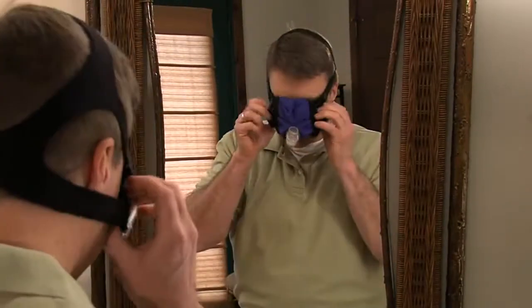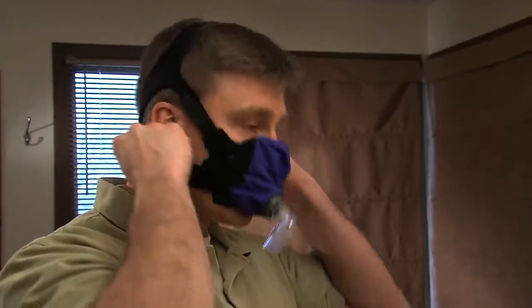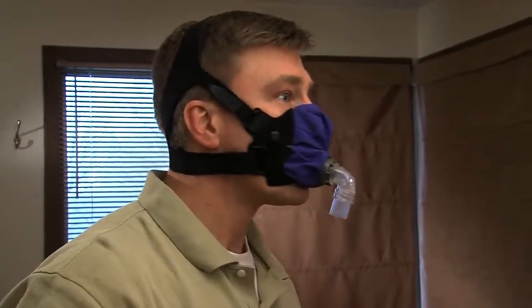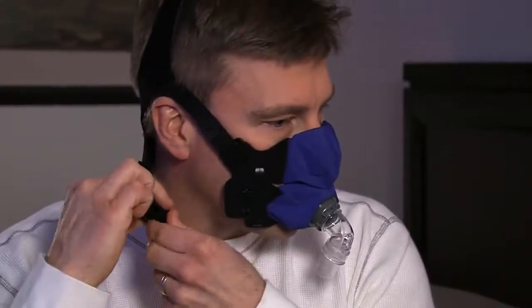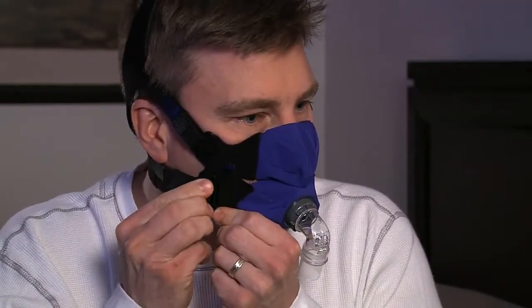It is recommended that you practice putting on and removing your mask in a mirror before your initial night's sleep. The SleepWeaver Anew Soft Cloth PAP Mask was designed with 2 quick-release clips to help you remove the mask quickly. Practice removing the mask by disconnecting only one of the quick-release clips and pulling the mask over your head. This will make it easy for you to put the mask back on the next time you use it, with minimal adjustments. We suggest that you practice attaching and disconnecting both quick-release tabs, tightening and loosening the top straps, and removing the mask entirely from your head until you are comfortable with how it functions.